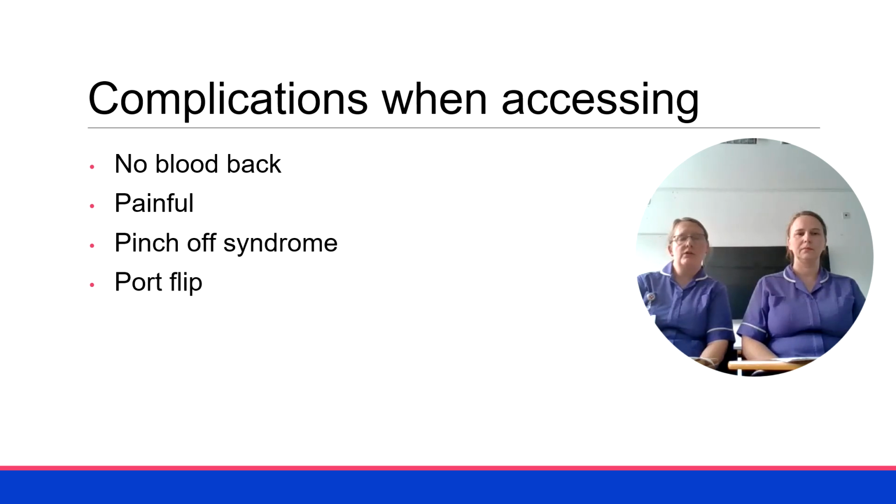You can also get pinch-off syndrome, which is where the line internally is stuck underneath the collarbone, and it could be causing a kink. And also another complication to look out for when you are accessing it is port flip, and this is where the Portacath itself has completely flipped over. So rather than when you're feeling the bouncy silicone in the middle, you would just feel the hard, flat base of the back of the Portacath.